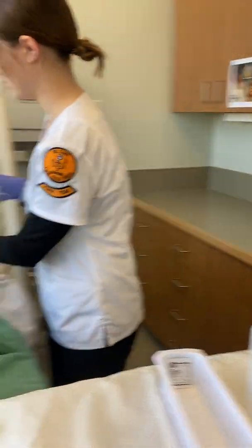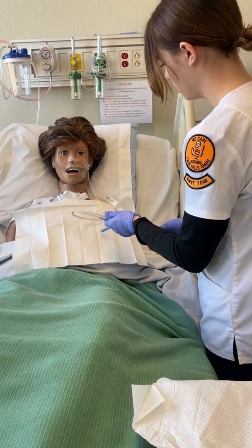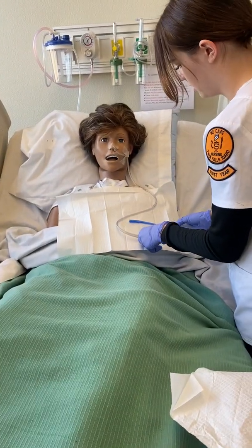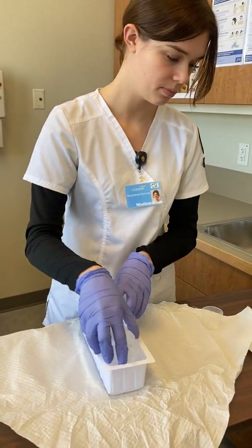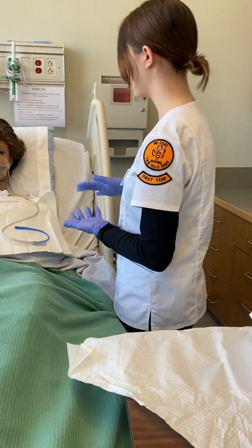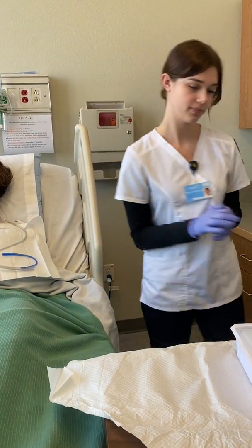Still feeling okay? All right. Just gonna put that back in and insert that water. Just irrigating. All right. So all done with that, okay? I'm gonna go ahead and clean everything up. And then your doctor has also ordered that we hook you up to suction. It won't be for too long, but I'm gonna go ahead and throw a few things away and then we'll get started, okay?